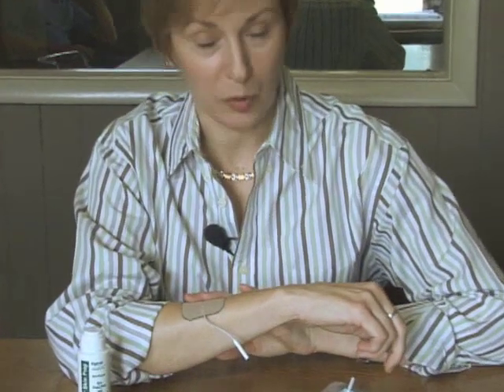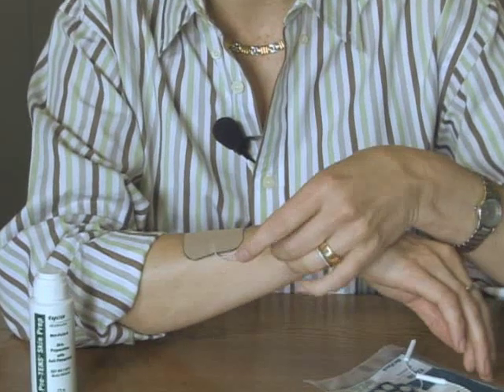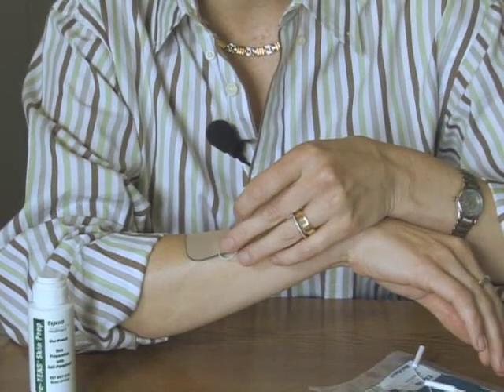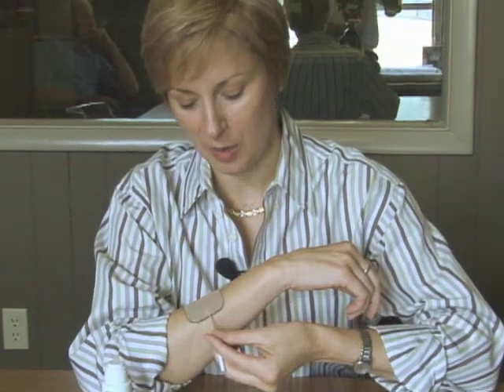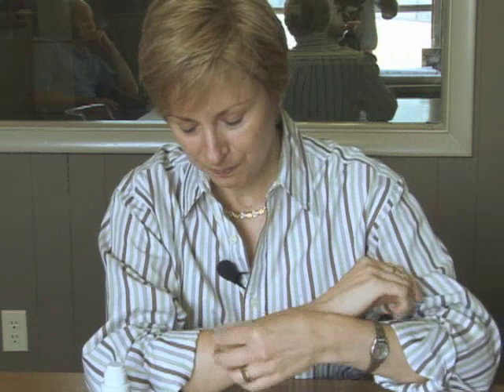And you'll probably figure this out from experience, but if you are placing electrodes on your back, for example, and then you're wearing the wires underneath your clothing, you want to think about which direction this wire is coming off. So if you've got the electrode on your back, you might want to make sure that the wire is going in a downward direction so that once you plug it into your cable, the cable can come out your shirt, and then you can attach the unit directly onto your belt and not have wires going every which way.